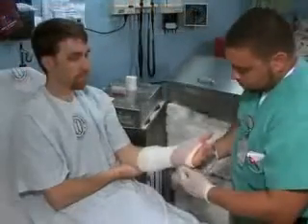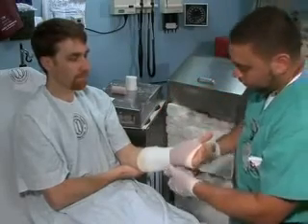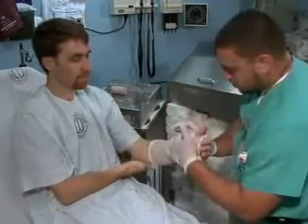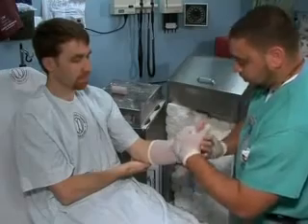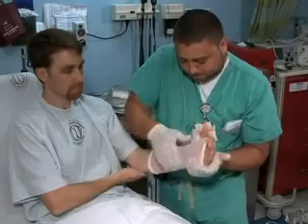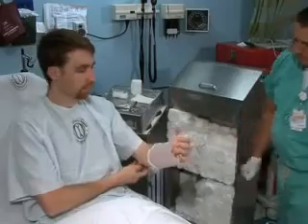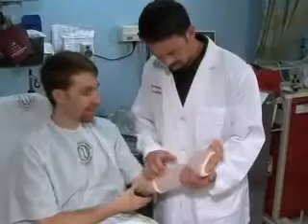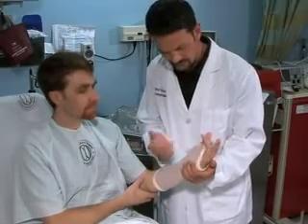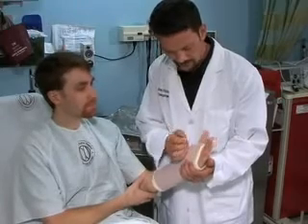Use an elastic bandage to secure the splint in place by wrapping it in a distal to proximal direction. Avoid excessive compression of the extremity when applying the elastic bandage. Before the plaster dries, place the extremity in the desired anatomic position. Use the palms of your hands to mold the splint gently to the extremity, taking care to avoid creating indentations that might lead to pressure points. Allow the splint to dry without further manipulation or patient movement. Avoid resting the splint on a pillow during this time, as heat buildup can cause thermal injuries as the plaster dries.